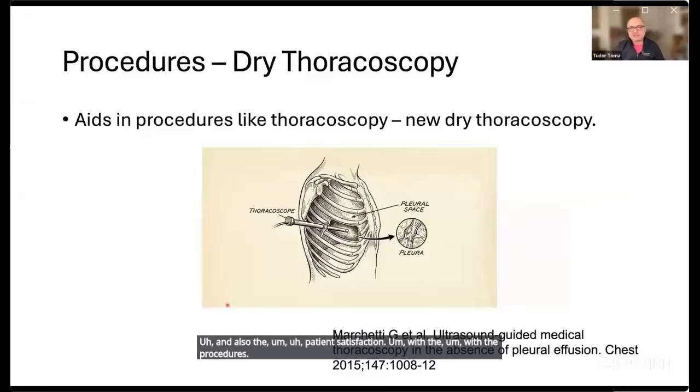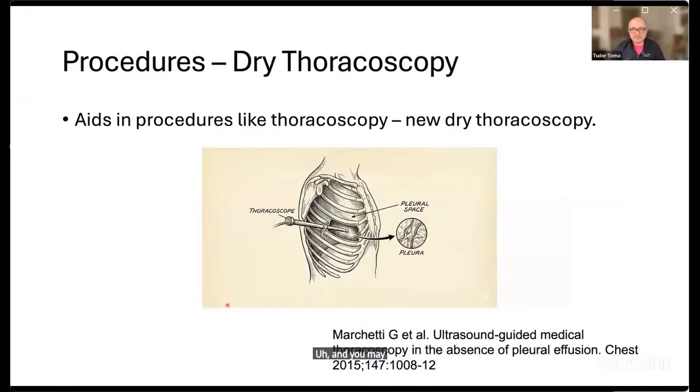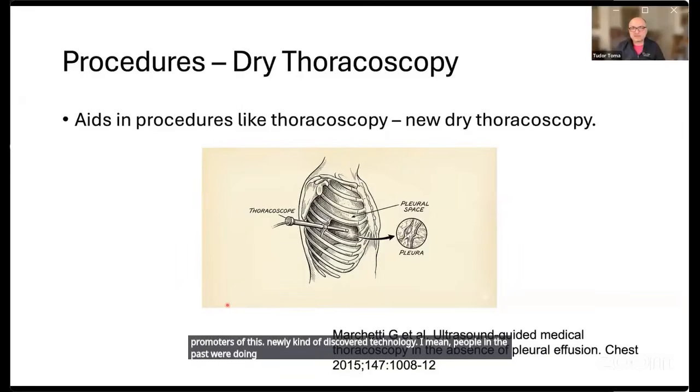An interesting development with the use of ultrasound is the dry thoracoscopy. And you may know that Dr. Marchetti from Brescia is one of the promoters of this newly discovered technology. I mean, people in the past were doing dry thoracoscopy, but it wasn't very safe.